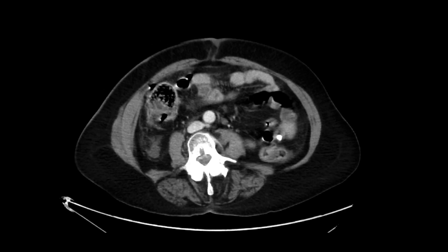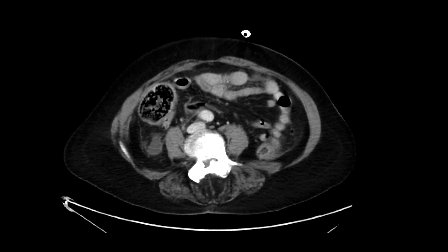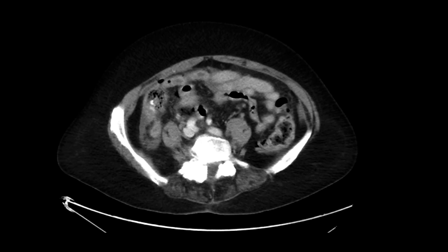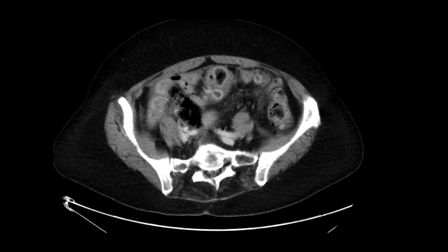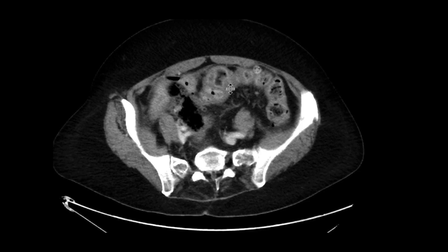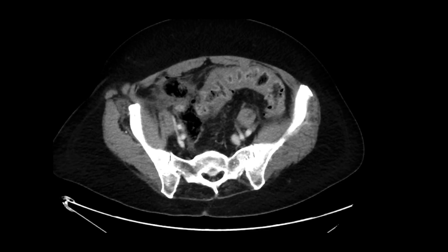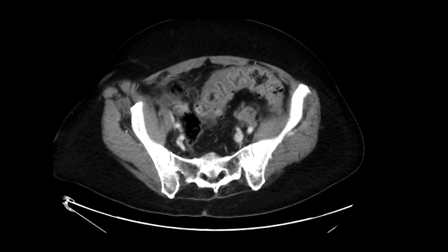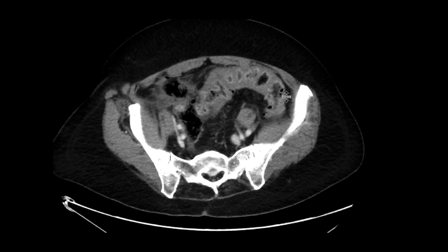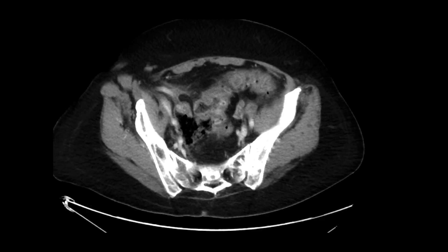All this free fluid suggests there's some inflammatory change going on. We can also see that some of these loops of small bowel look a little bit thickened — granted, they're underdescended, but they certainly look more thickened than they should. There's quite a bit of stool, and some of these loops of sigmoid colon here also look thickened.